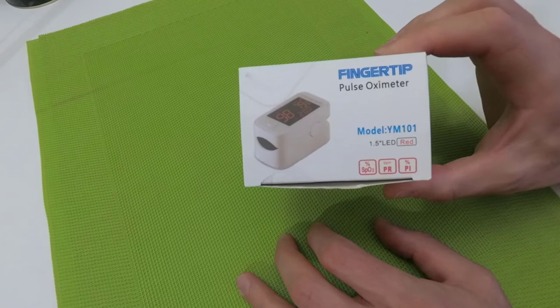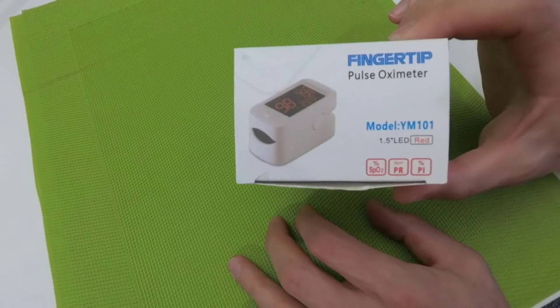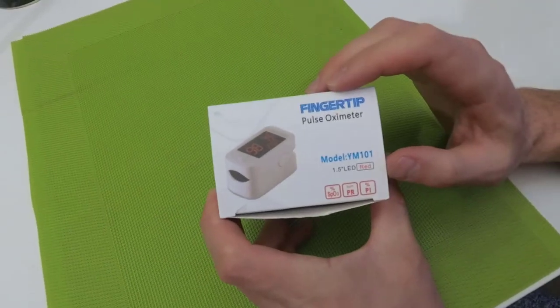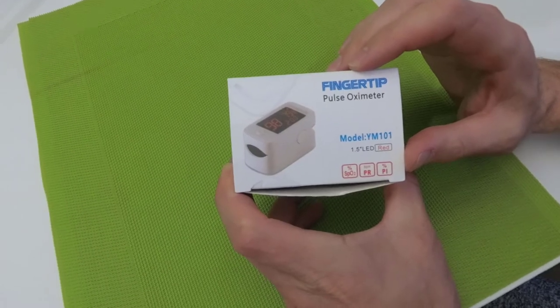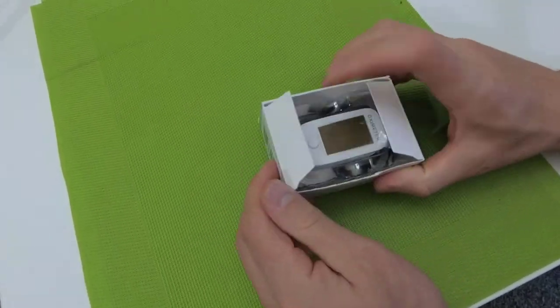Hello guys, I'm Tommy Professor, and today I'm going to be very serious because I'm going to make a presentation of a device that helps keep our life and living healthy. It's a very useful device that is very relevant now at the time of the coronavirus pandemic, as it helps you to control the physical data of your body. Let me open it to show what is inside.